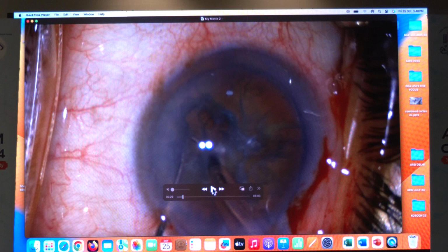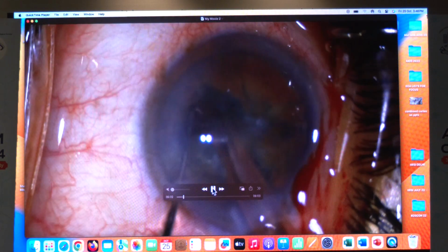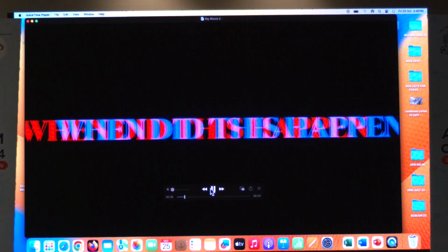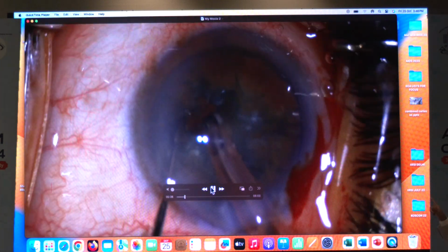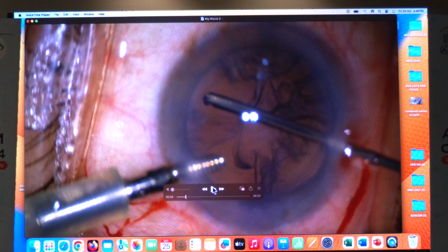Now see here. See what I am doing is, see here. So can you see this? What has happened? Now, yes, I was trenching, and during trenching only, can you see this? Now why has this happened?